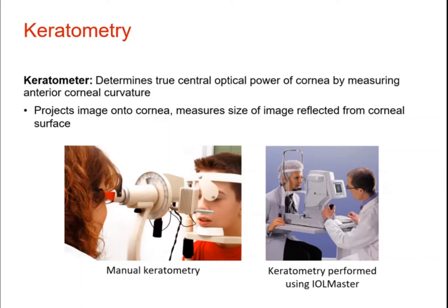The manual keratometer tends to measure a larger surface area of the central cornea, up to 3.2 millimeters, whereas auto keratometers, such as the IOL master or the auto refractor, measure a smaller area of up to 2.5 millimeters. So the difference in the area of measurement does contribute to slightly different measurements that you see recorded on the patient's case sheet, right?